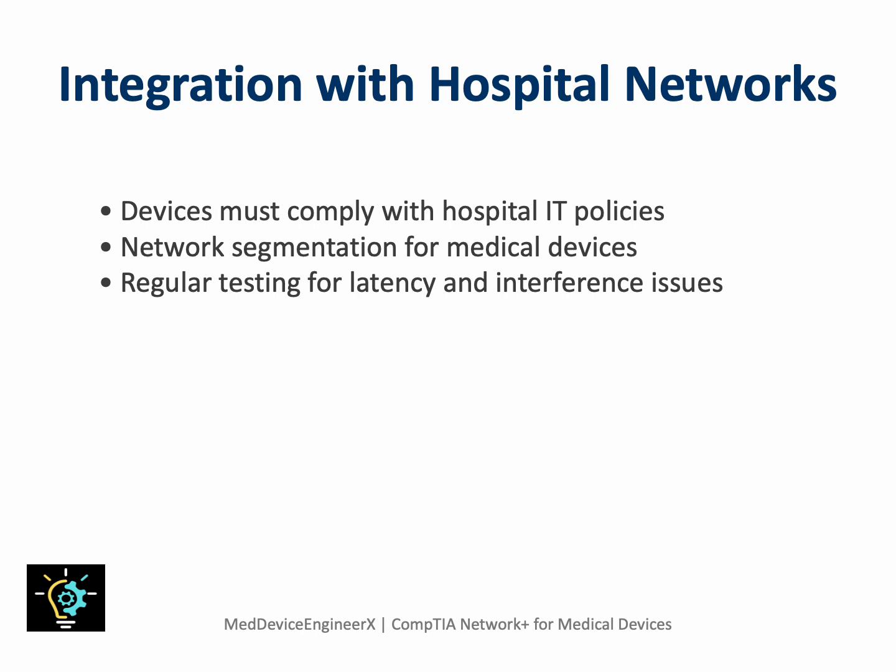Engineers must validate compatibility between devices and existing infrastructure, ensuring smooth data flow without delays. For instance, large imaging systems may use dedicated VLANs. Latency, bandwidth, and interference must all be tested during installation. This integration ensures clinicians receive timely, accurate information while keeping the system resilient against network congestion or external attacks.